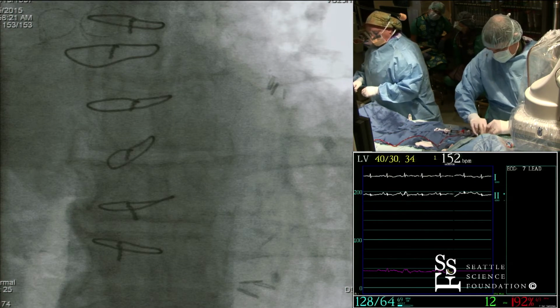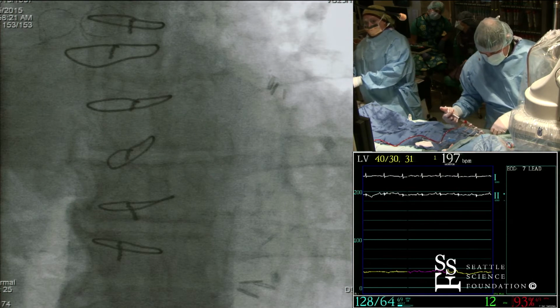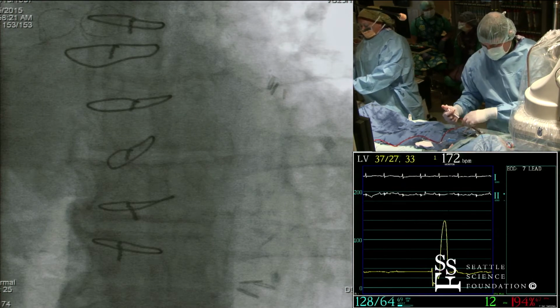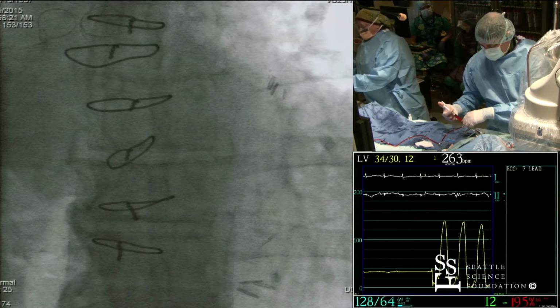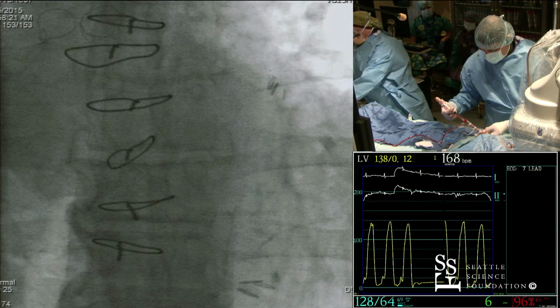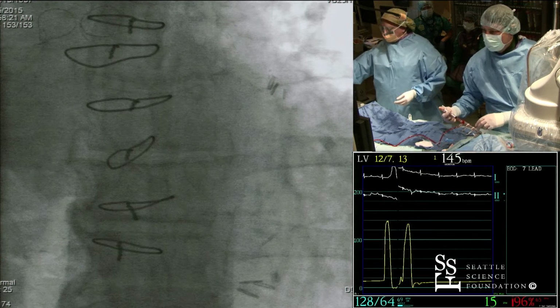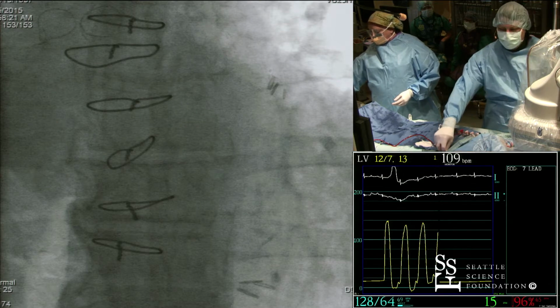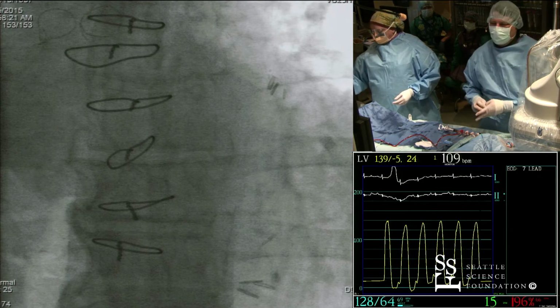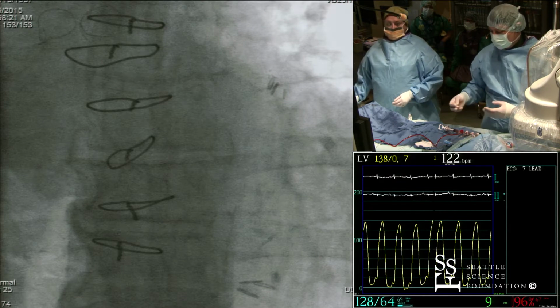So John, we have lots of aortic stenosis cases. What's the catheter of choice that you use to cross the valve? To cross the valve, typically I start with the Judkins 4 still, like you learned in fellowship. Right, and then it depends. I'll change out based on where I think the jet is, and do I think I'm getting perpendicular with the jet?